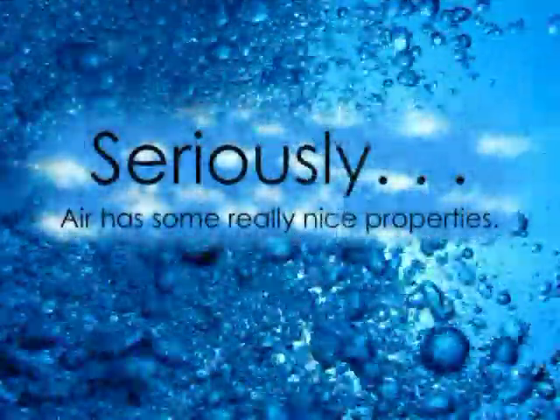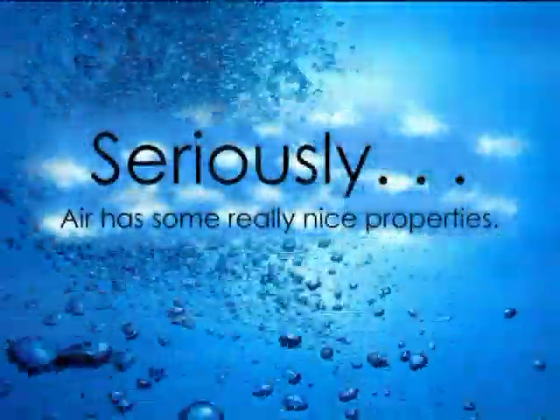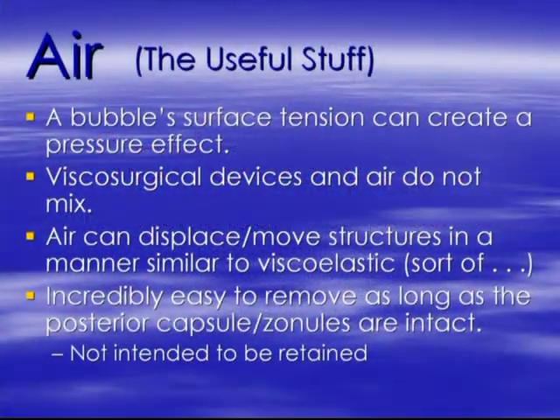In all seriousness, air has some very useful qualities. Specifically, a bubble's surface tension can create a pressure effect. Viscosurgical devices and air just don't mix. Air can displace or move structures in a manner similar to a viscoelastic, and air is incredibly easy to remove as long as the posterior capsule and zonules are intact. It's also not intended to be retained.